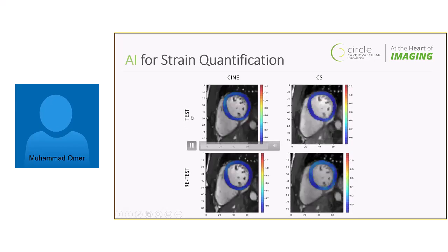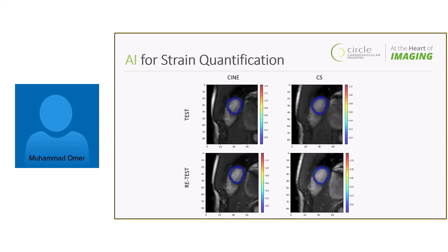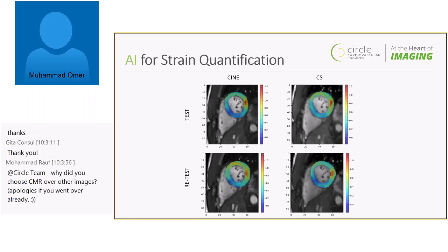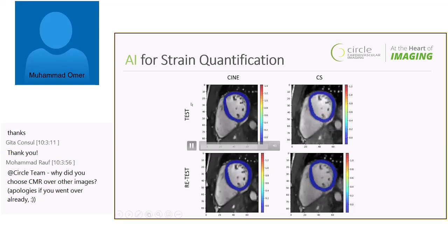The objective here is to see if our machine learning algorithm has learned enough information to predict the actual displacement without being impacted by the differences of modalities or differences in the patient position or intensity information.